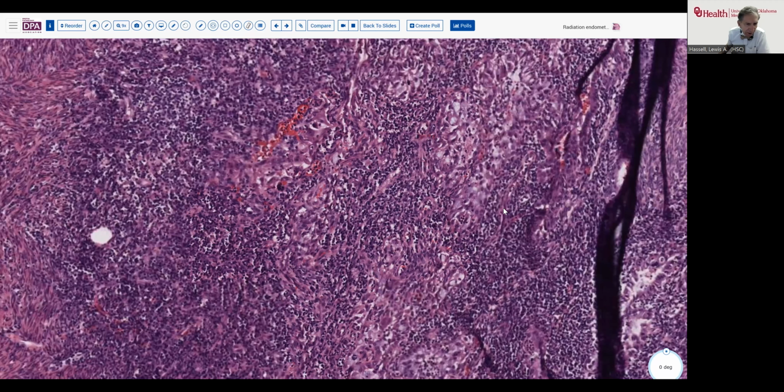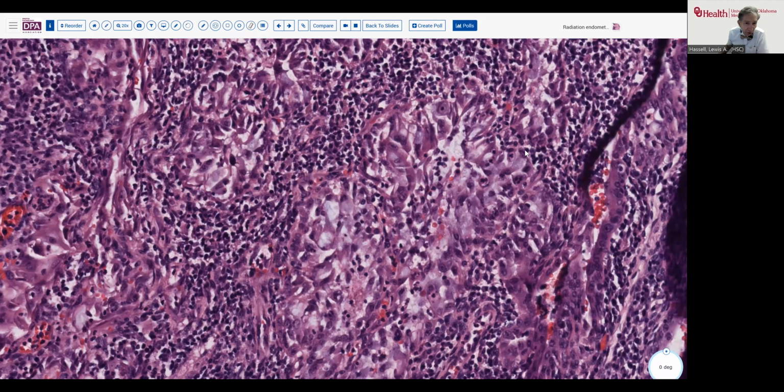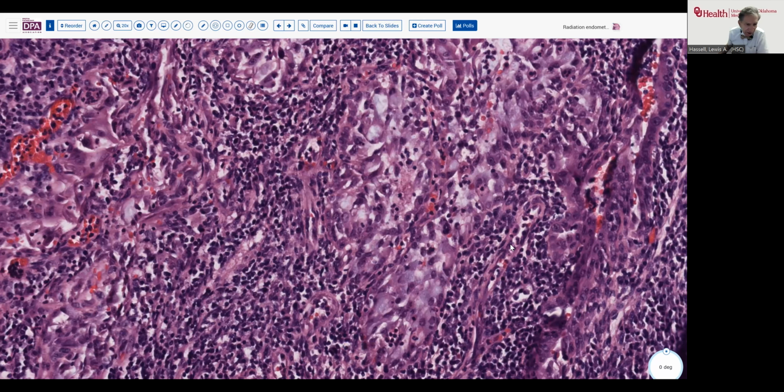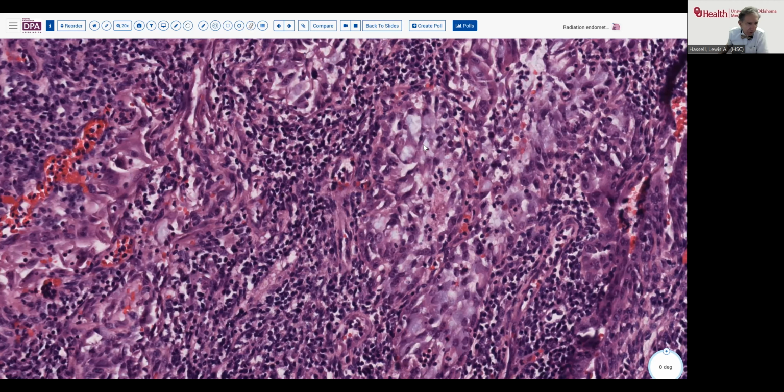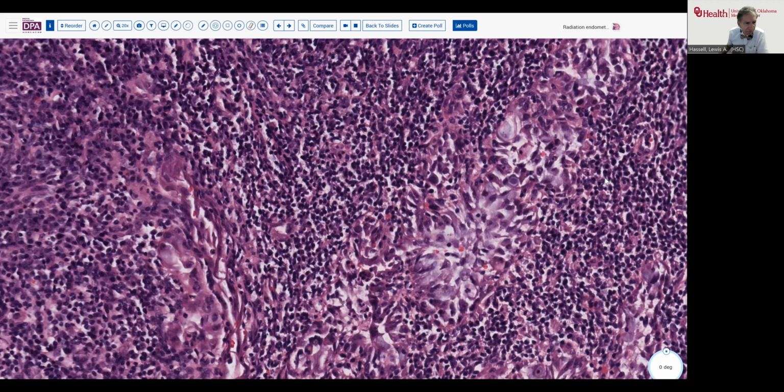Now, it may be that here we can see a difference between those other glands. And so here, I think what we're seeing, you can see more pronounced nuclear enlargement, larger cells overall. And so this is treatment effect on the intraepithelial component of this endometrial carcinoma. So here are some very plump, large cells with clearly some degenerative type changes that make them look different and distinct from those other endometrial basalis glands. And there's some surrounding inflammation.